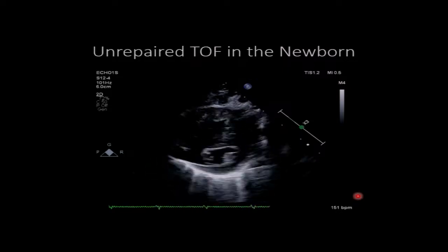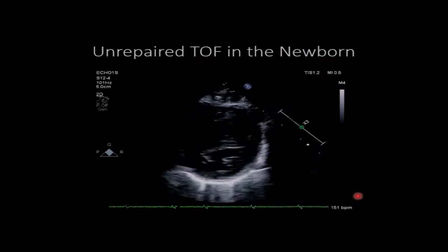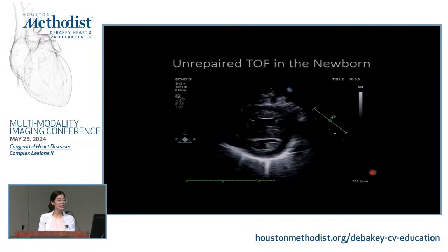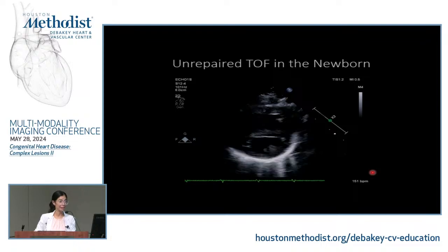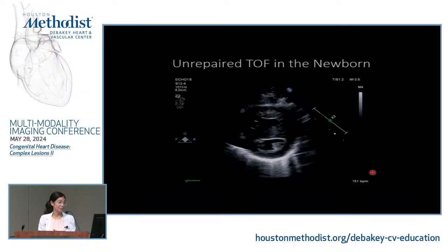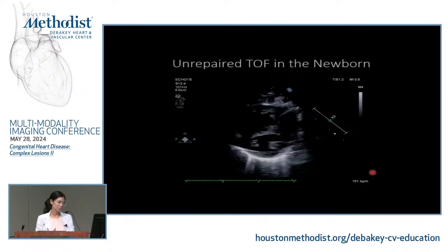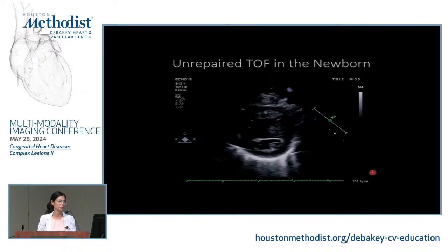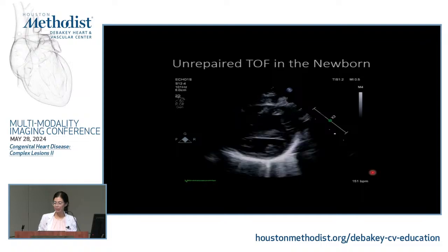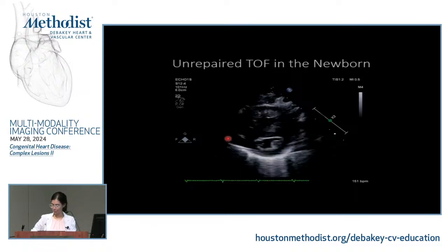In congenital echo, do you only flip the images in the 4-chamber view or all the views? Oh no, they flip them all. The reason they're flipped is that in congenital heart disease things are not in the standard position, so it helps understanding sidedness when you use their approach. It's easier to understand what is right and what is left and the relationships. So that's why.